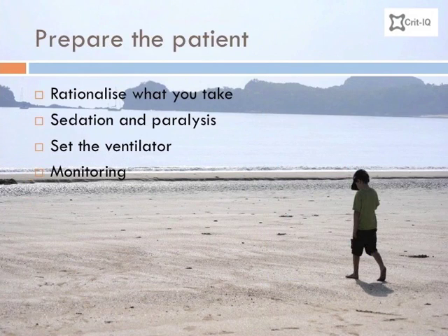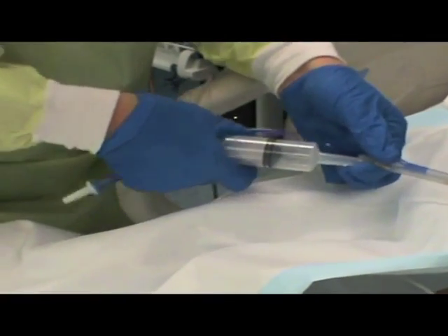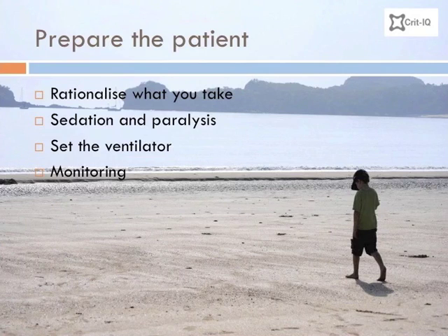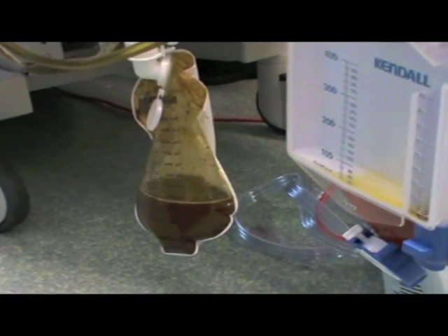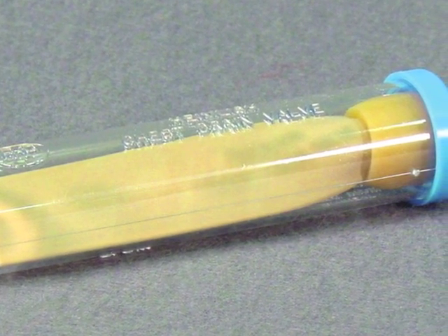Wherever possible, try to rationalise the amount of equipment, drugs and fluids you take with you. Consider giving the patient bolus sedation instead of an infusion, or combine infusions together, for example morphine and midazolam. Consider the need for feeding. If possible, cease it and aspirate the stomach. Remove unnecessary monitoring such as central venous pressure or urinary bladder temperature leads. Empty drain, nasogastric and urine bags to make life easy, and consider changing underwater seal drains to specialised transport Heimlich valve systems.